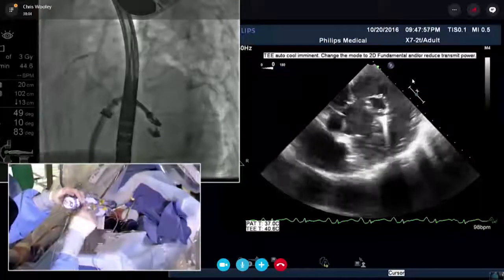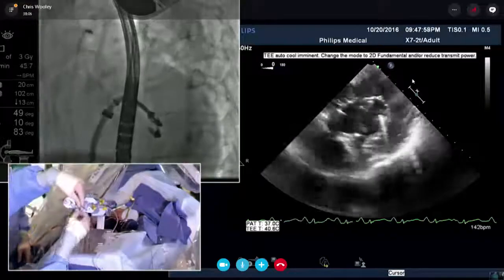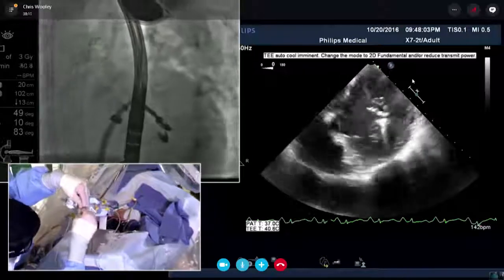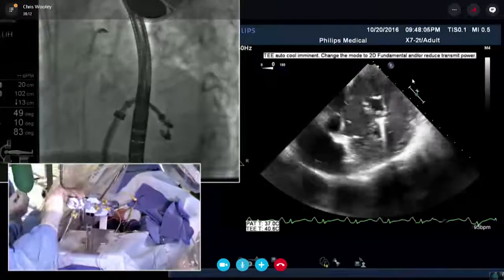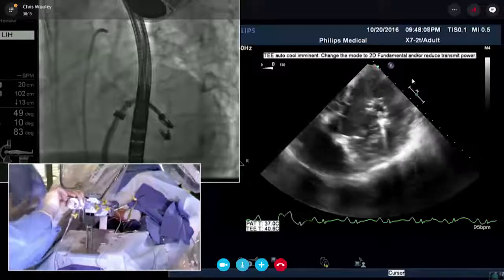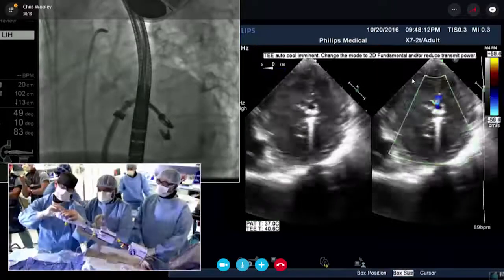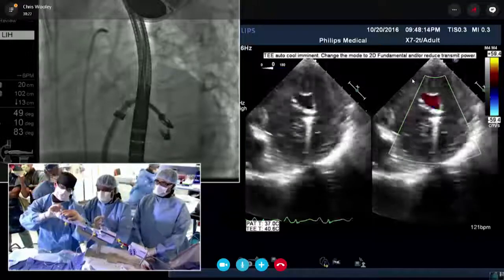Did you see how poor the ventricle function is? And this is probably one of the only technologies that can be done in such a low ejection fraction. Surgery, no surgeon would like to operate on these patients. I think transcatheter mitral valve replacement in such low ejection fractions will be a travesty.